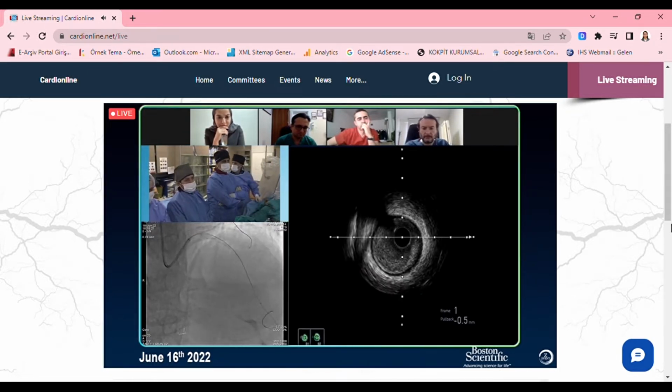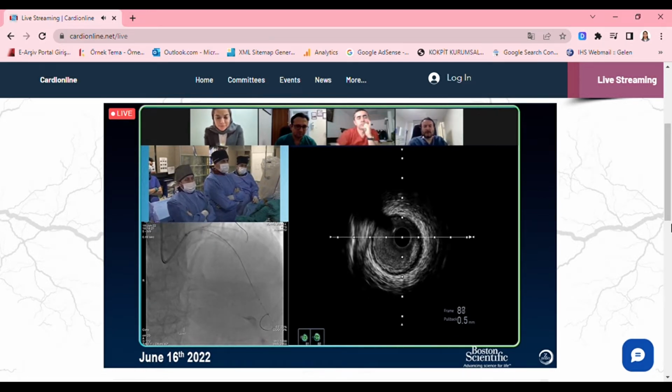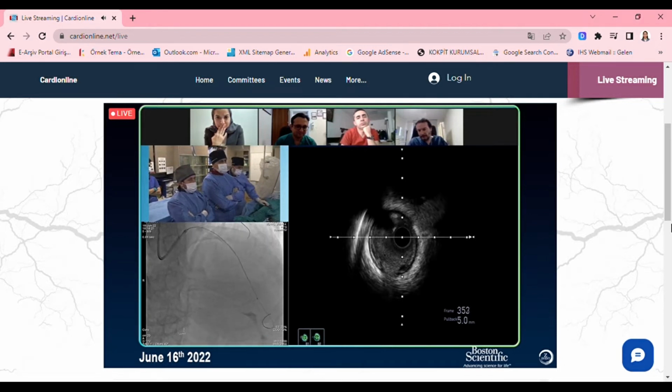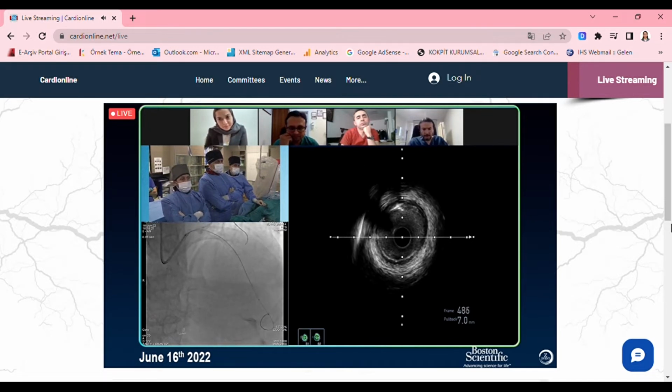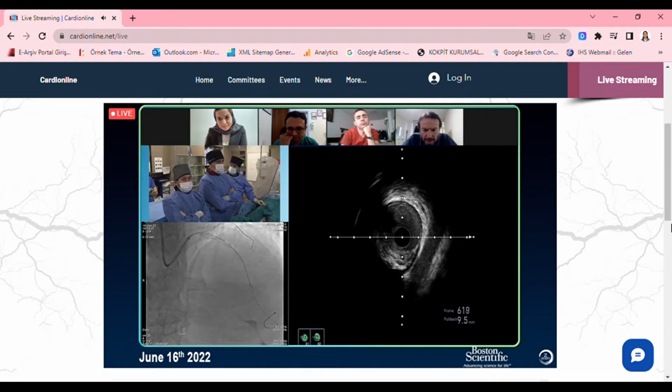Bigger, please. Did you have trouble advancing the IVUS catheter? No, it was straightforward. Okay, play please. Is this the Opticross IVUS? Yeah, this is the Boston HD IVUS, Şevket. This is the distal healthy part. In here, the vessel is around 3.1. And now we are coming to the disease part.